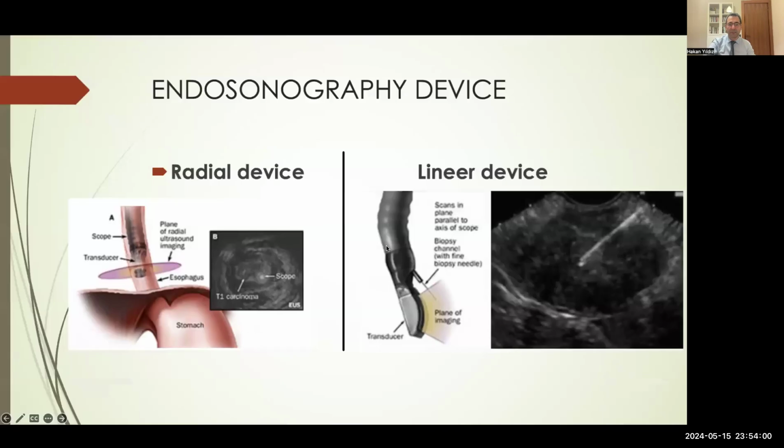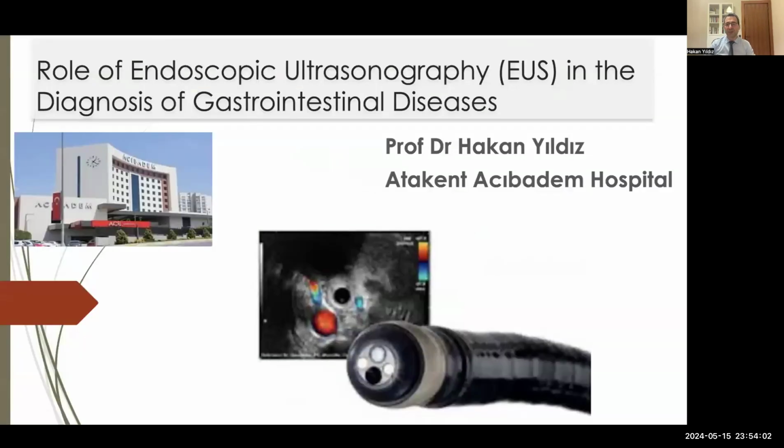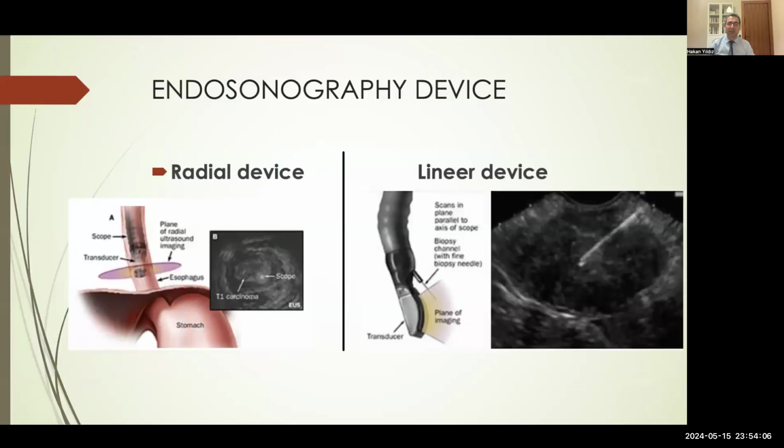My topic today is the role of endoscopic ultrasonography in the diagnosis of gastrointestinal diseases. In daily practice, we use two devices, a radial device and a linear device.